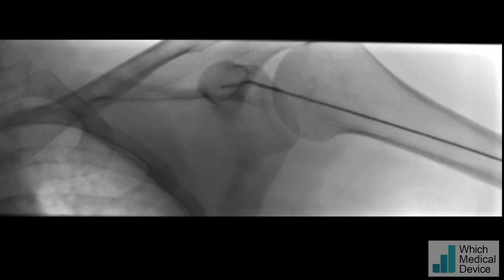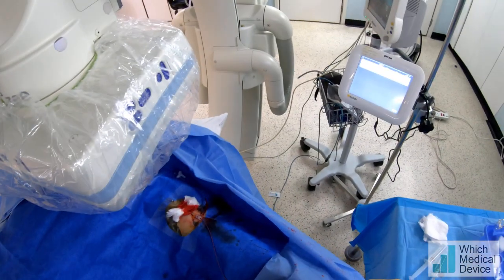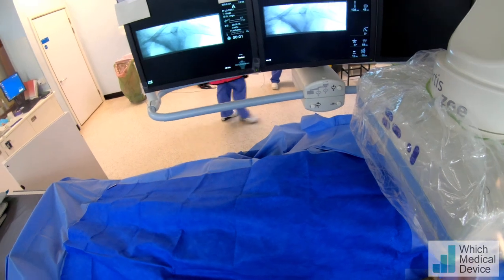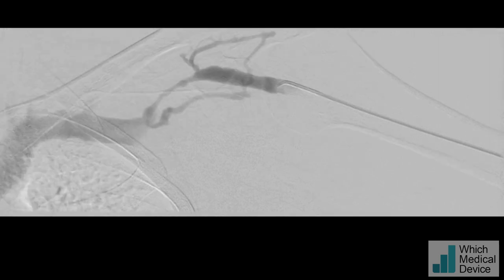If you could breathe in for me, breathe out, take a small breath in and hold it there — very still for me, nice and still, warm feeling coming up — and breathe away. That shows a very tight stenosis around the cephalic arch, which actually looks tighter than it was last time it was plastied about two months ago.